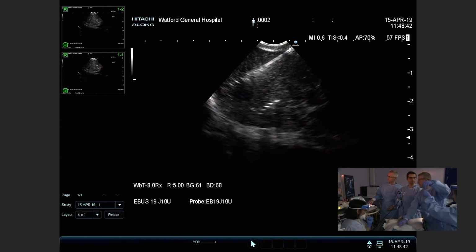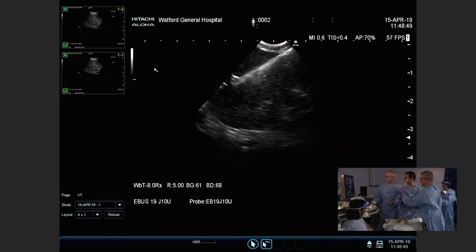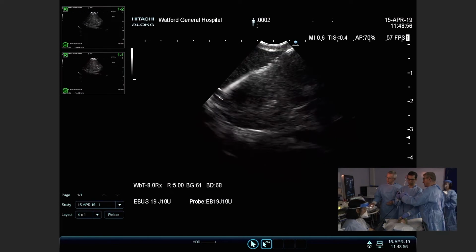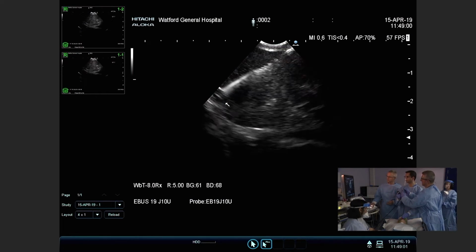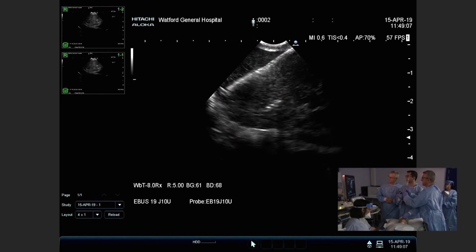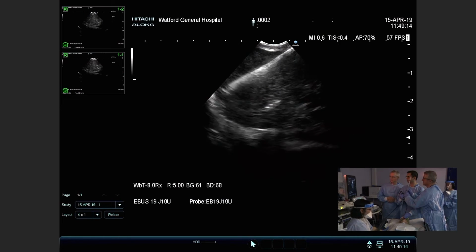And as you've said before, it's really important to visualise the needle for its entire length so that you're conducting a safe test. Now you can see the telltale sign of the needle there. I've stopped the needle there. I'm going to set the needle length so that it cannot go beyond that point. So we can now conduct a safe process of agitation, or passing the needle in and out of the lymph node, without transgressing the capsule, without going into adjacent vascular structures.